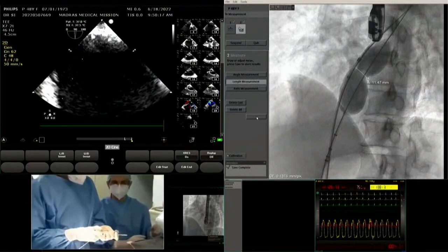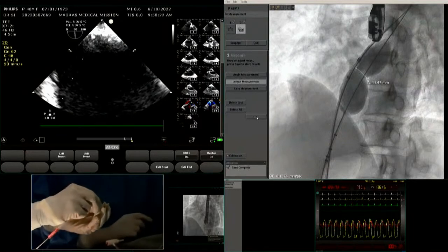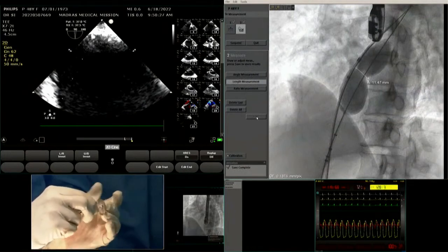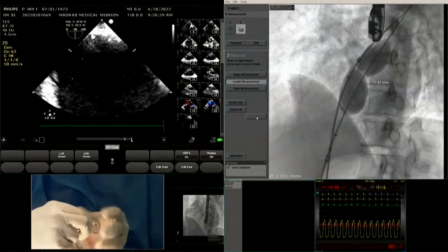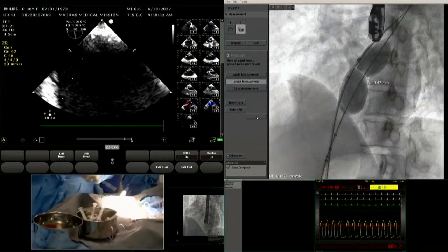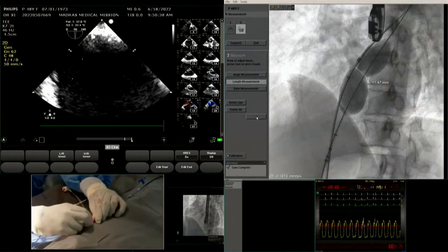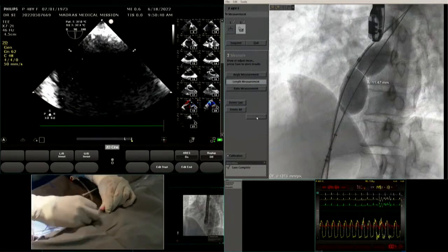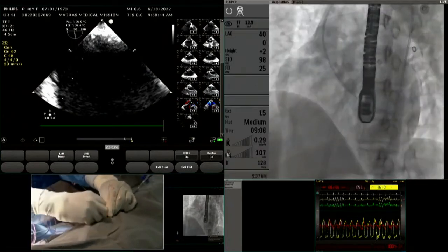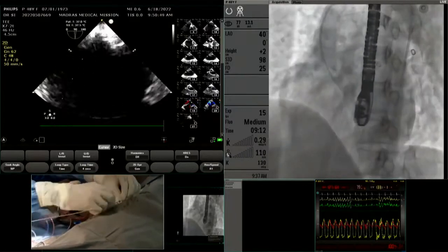Actually, we are running short of time now, so let me make it a little faster. Alka, the smaller device is on the left side, right? So now I am taking the smaller. Keep the second device ready. I want a 24 device. It was a 24 size, right? So give me a 26 device on the top. So I am upsizing by around 2 millimeters for the lower defect.